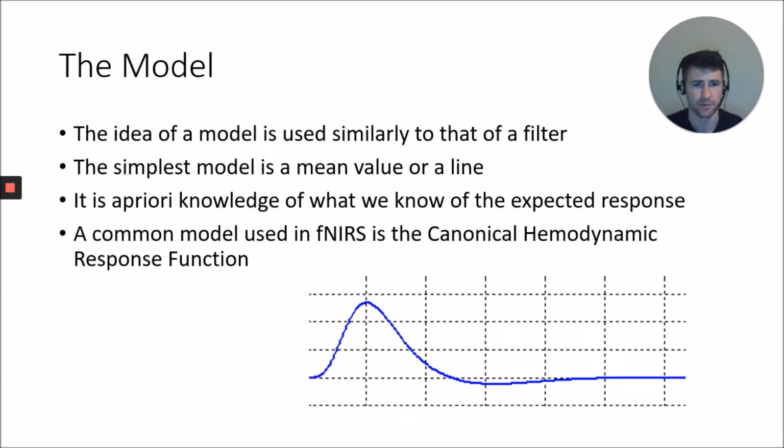The other idea would be a bandpass filter. You have a frequency here and a frequency here. I only care about what's in here, and I'm going to ignore everything on either end. So each of those is a filter.